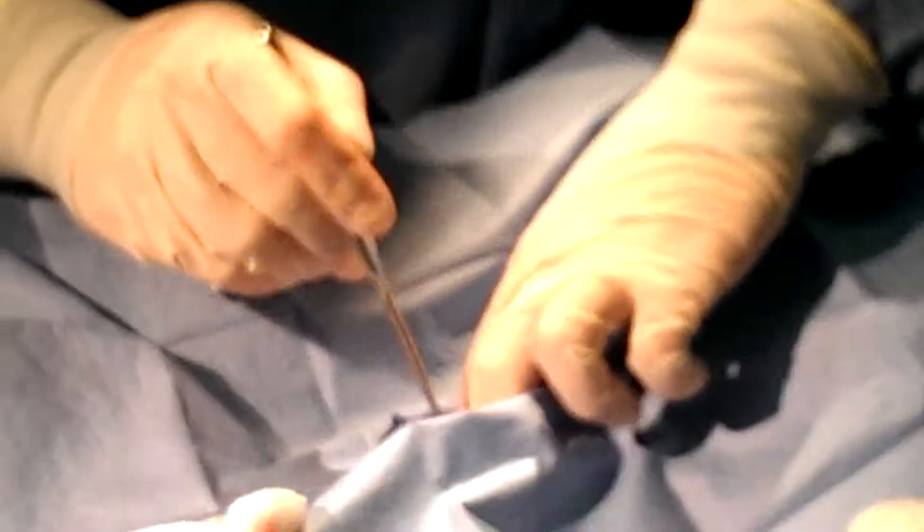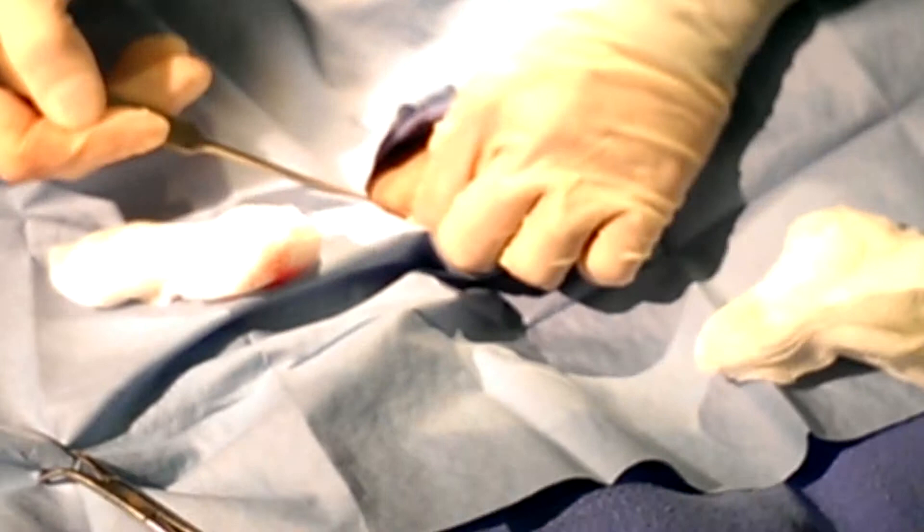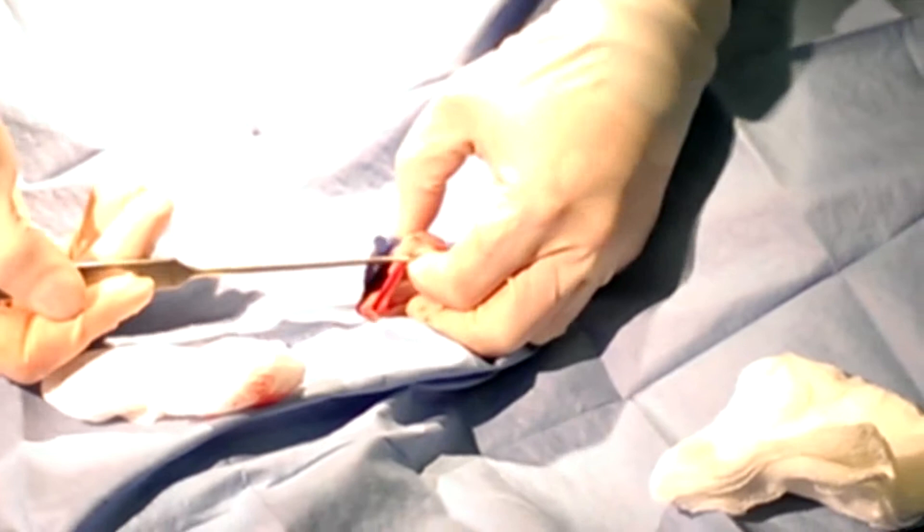I'm continuing to push some of these small intestines out of my way. With my fingers right now I can feel the descending colon — it should be there and everything else is hidden. I don't necessarily need to look for it. When you're putting in the spay hook, I'll typically ride across the top of the interior abdomen so I don't catch on anything, then flip it and try to snag deeper along.